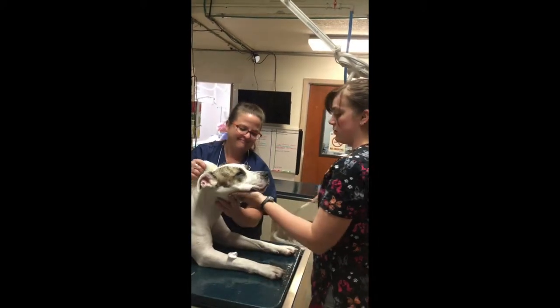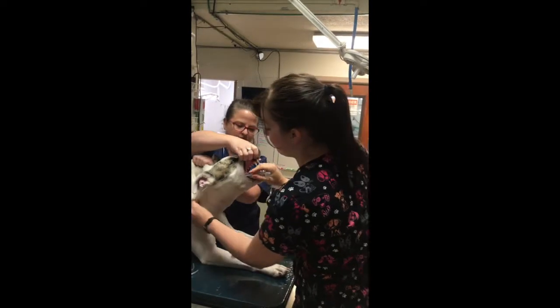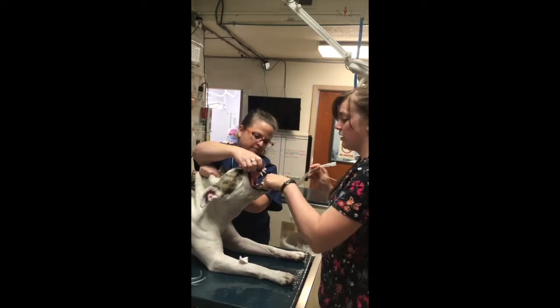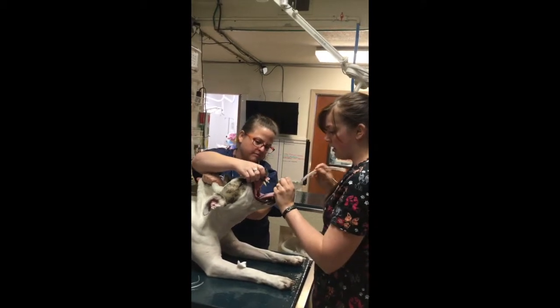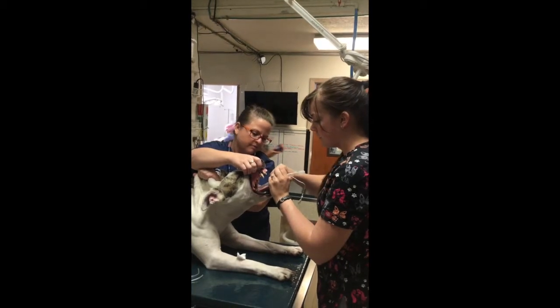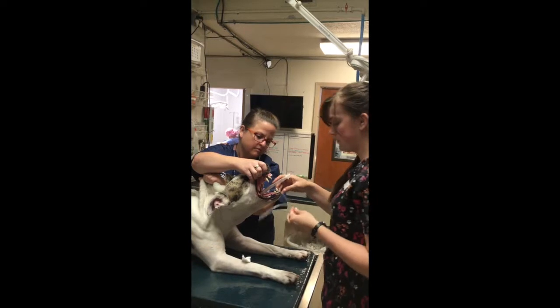I'm going to go ahead and intubate. This tube's been chosen for the appropriate size. I'm going to go ahead and measure. So it's going to be tied off about right there. Head, push down, push the epiglottis down, and insert gently. About right there is where we're going to stop.